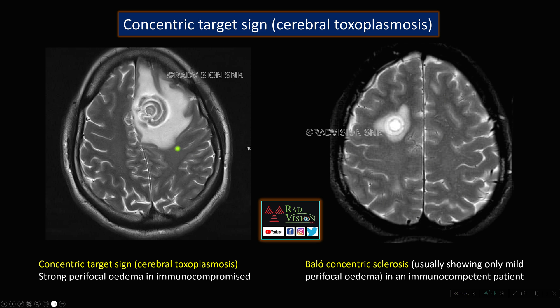Next: what is the concentric target sign? Here you can see there are concentric rims of membranes which typically mimic the concentric target appearance, classically seen in cerebral toxoplasmosis with significant perilesional edema. However, a similar concentric appearance is also seen in Balo's concentric sclerosis, which is typically seen in immunocompetent patients with mild perifocal edema. In cerebral toxoplasmosis, the concentric target sign is seen with significant perifocal edema and is commonly found in immunocompromised patients.